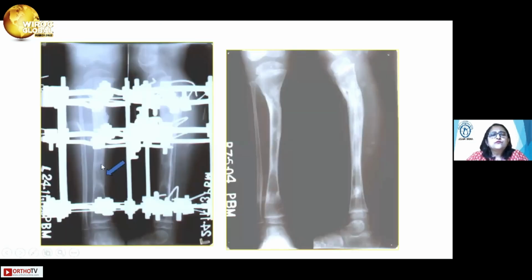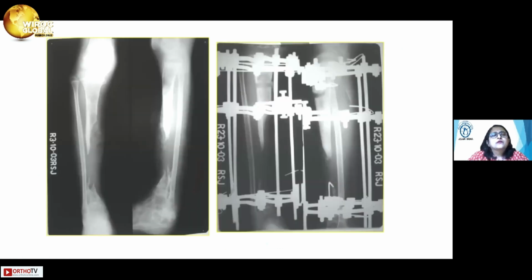And you can see good bone formation. In children, you can get away with a diaphyseal corticotomy. They throw quite good bone and it united very well. She had a little recurvatum deformity, but she was a young child, so it remodeled.